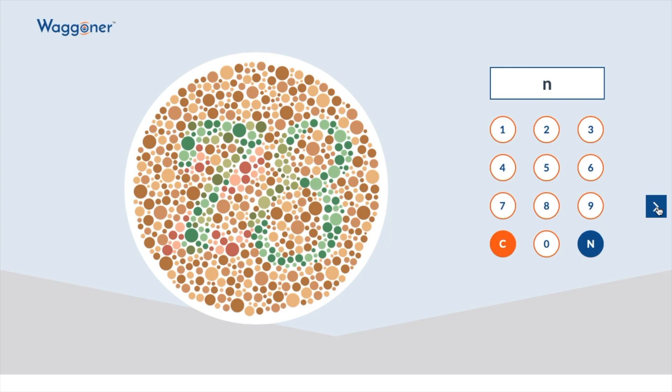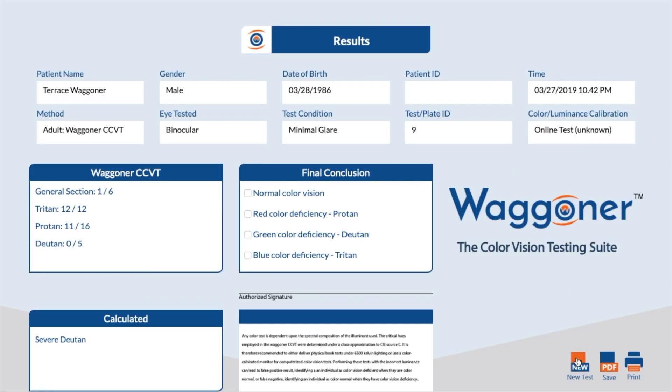After the entire test is over, the results page will begin loading. You can then review the results and either save them as a PDF or print them.